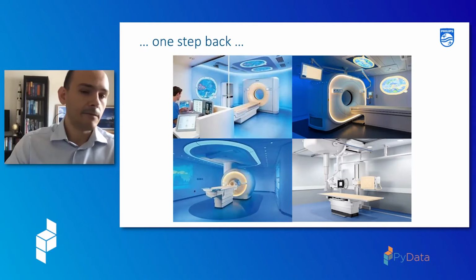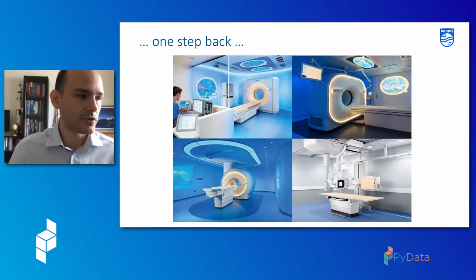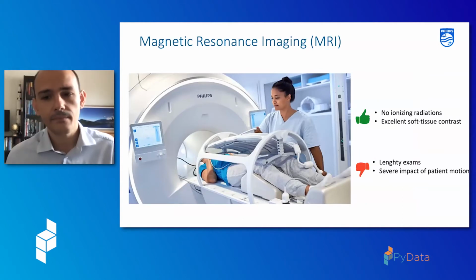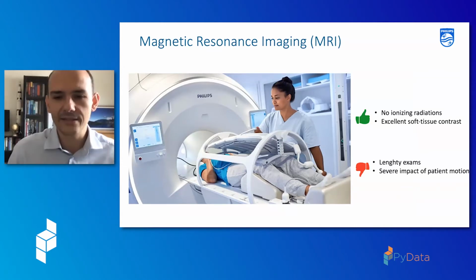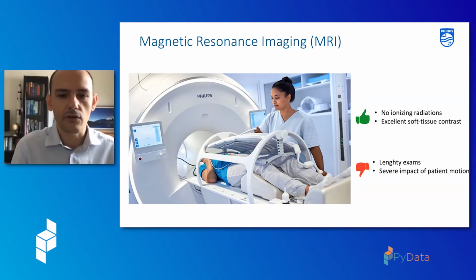All right. Among these imaging modalities, you can see here there are MRI, CT, X-ray scanners. I'm going to focus on a specific one, and that's magnetic resonance imaging, or MRI. You see a scanner here on the left. It's one of the very nice imaging modalities because it has very nice properties. First, it does not have harmful radiation for the patient. So you can take as many MRIs in your lifetime without having any issues, compared, for example, to X-rays. And moreover, compared to the other modalities, it also has a very nice definition of the images. So you can really see the soft tissue that usually you cannot see in an X-ray.